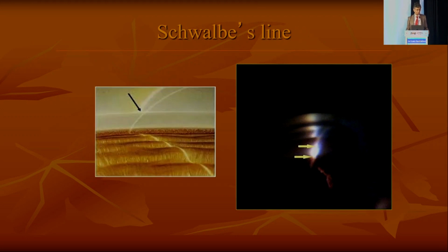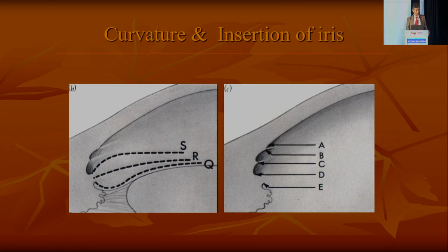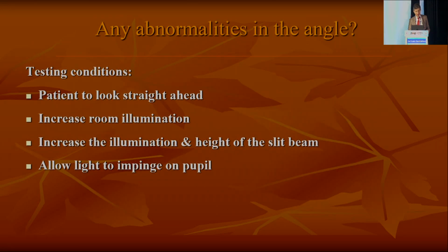And then you have to start looking from the anterior region. If you make a very thin wedge, you can identify the corneal wedge where it meets and identify the Schwalbe's line there, and then you can see the angle and then the ciliary body band. So this is in the clinical picture. You can see the collapsing of the two parallelepipeds into the Schwalbe's line. Then you see the curvature of the iris, whether it is flat, or sort of bulging in front or bulging backwards, and identify the various structures of the angle.